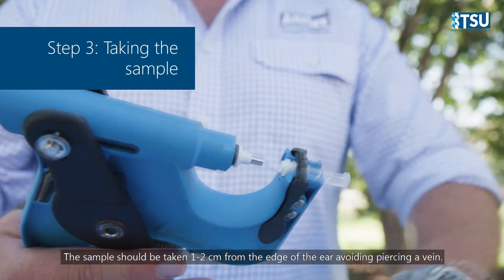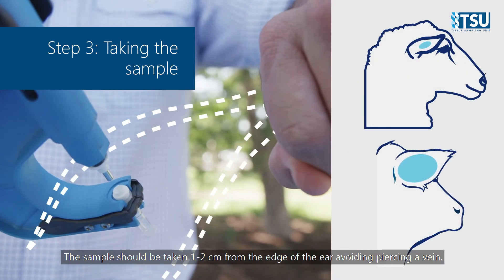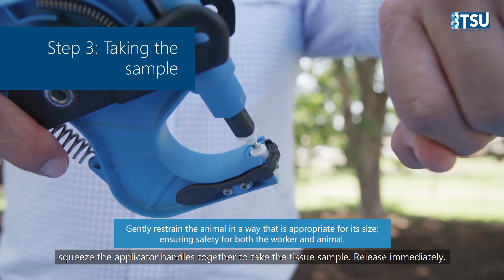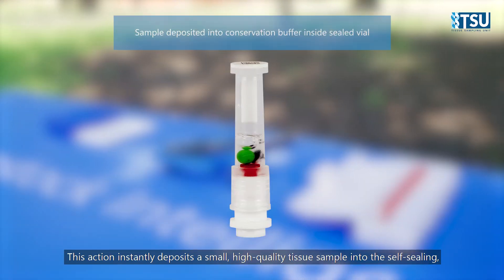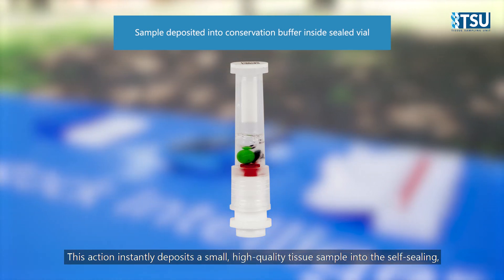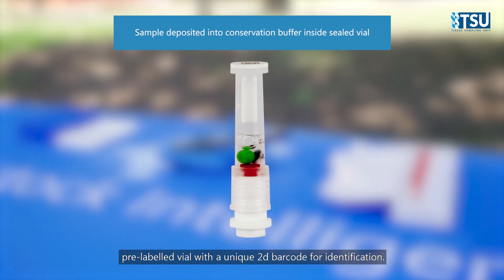The sample should be taken one to two centimetres from the edge of the ear, avoiding piercing a vein. Slide the ear within the loaded applicator and in one swift, smooth motion, squeeze the applicator handles together to take the tissue sample. Release immediately. This action instantly deposits a small, high-quality tissue sample into the self-sealing, pre-labeled vial with a unique 2D barcode for identification.